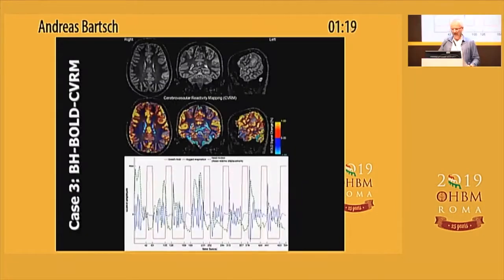And that's the cerebrovascular reactivity map. Let's start with the bottom. In red now you see the breath hold commands, and in blue the logged respiration. And you can again see that the patient complied. And now, for Mark Jenkinson, you see head motion stops when you hold your breath, which is what you would expect when you stop your breath motion. And the head motion parameters I estimated by FLIRT reflect that.